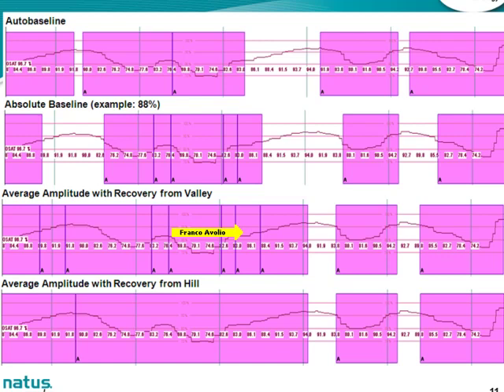So when you see something like this short one here, you don't even see the drop, and it's the same thing here. You really don't see a drop there. Though you don't see a drop in the previous 10 or 20 seconds, it may still be comparing that particular signal with an amplitude that was computed using data perhaps a few minutes ago. But that's not readily intuitive by looking at it on screen.